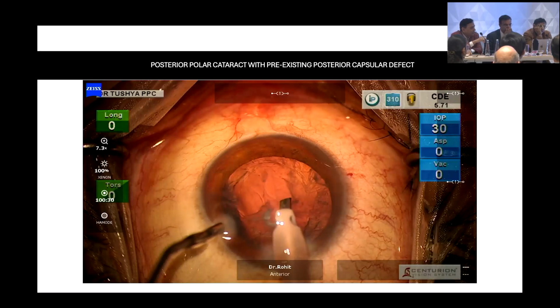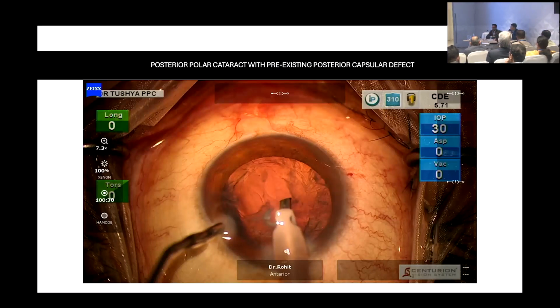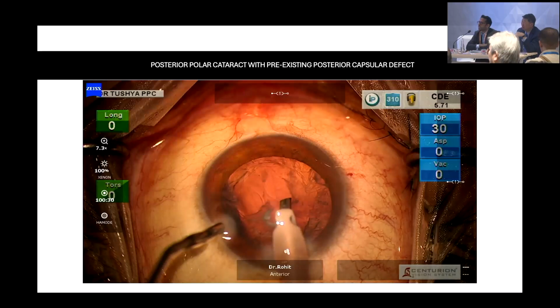David, would you go ahead putting a toric IOL in this case? And how much power of a toric does she need? It was not the extreme height. Yeah, yeah. So, I think if the toric isn't on axis, you haven't really accomplished anything. So I think you certainly can't argue with a monofocal 3-piece in the sulcus, and maybe do astigmatic keratotomy while you're there.